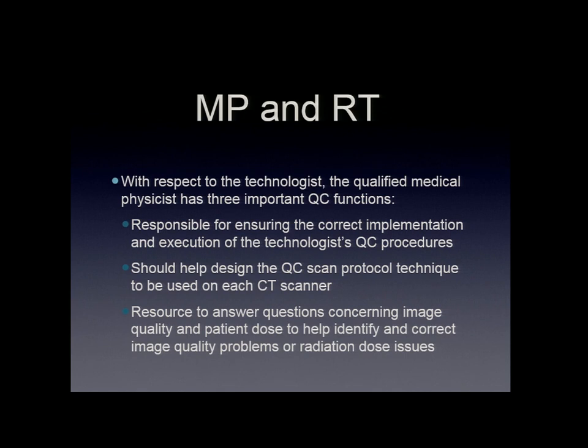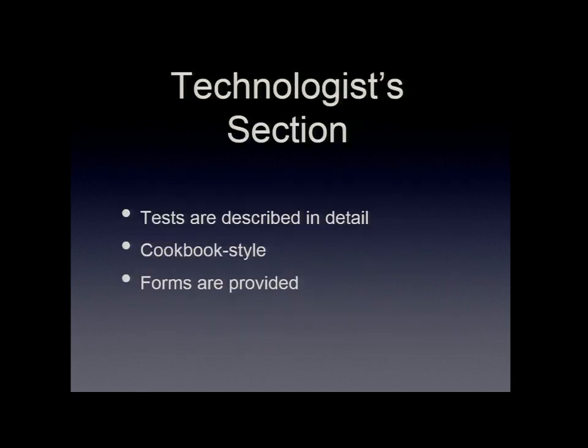They need to get service in here and make a correction, give them guidance, like, maybe it's just run some more air cals or do a full calibration. Maybe that will take care of things, and we'll take a look at that. So any issues that come up, we should be available.